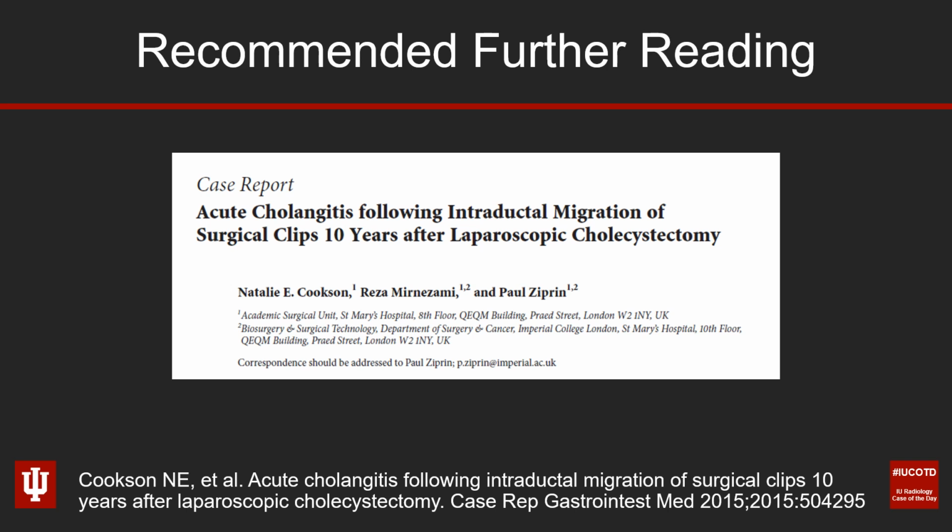So I was able to find a case report on acute cholangitis following intraductal migration of surgical clips. This was almost 10 years after the laparoscopic cholecystectomy for this particular patient.